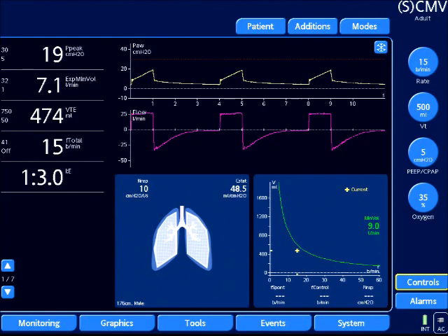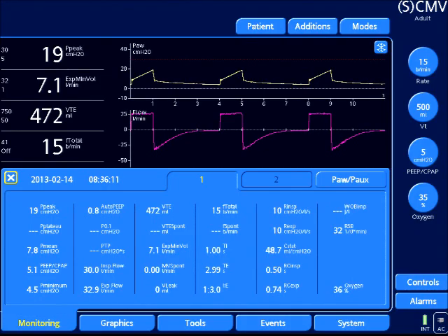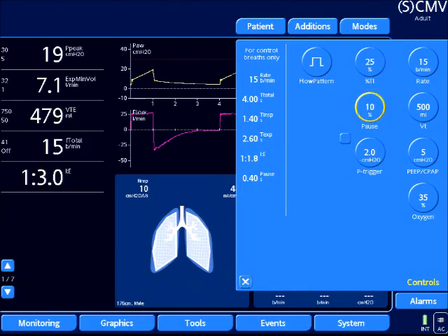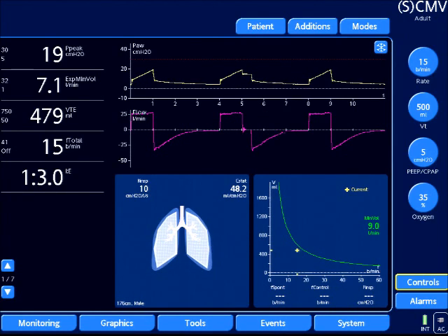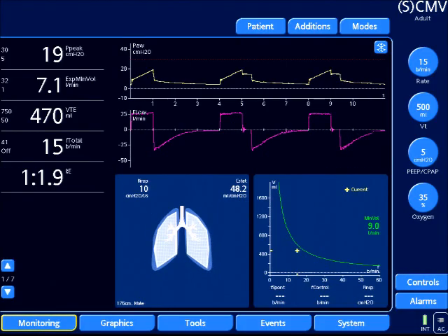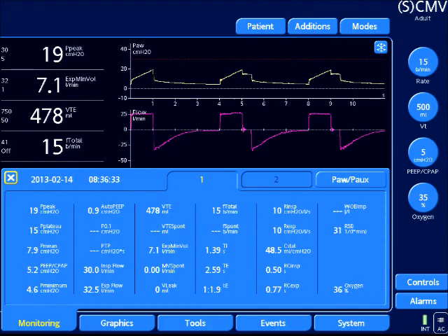To obtain a plateau pressure during volume control, we can set a pause. I'm going to go under the monitoring tab — and you notice under plateau it's dashed out, so there's not a measured value. What I need to do is create a pause. I'm going to select pause and set a 10% pause. If you look at the pressure waveform, it's creating the plateau pressure. Now we can go back to my measured values and we'll see a plateau pressure of 15 centimeters of water. That's the easiest way to do it in volume control ventilation.